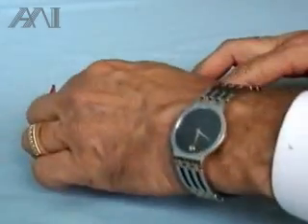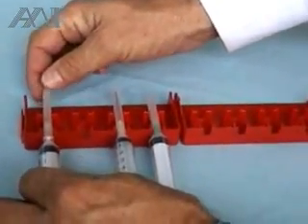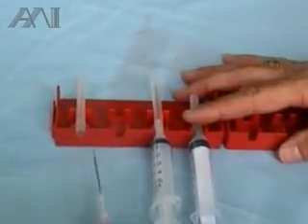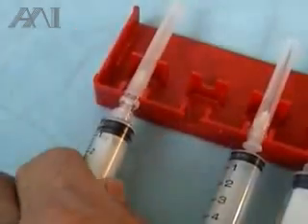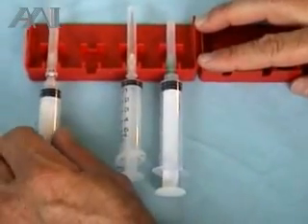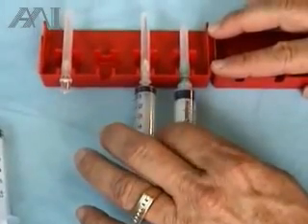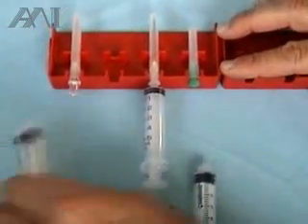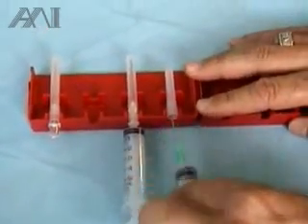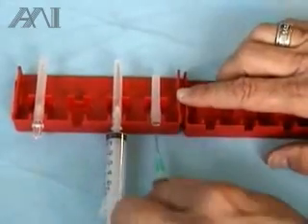The syringes are loaded onto our syringe recapper into the slots. You can remove the needle without the cap, or you can remove the needle with the cap. You can also exchange needles between syringes, if you so desire, and remove them with the capper and without the cap.